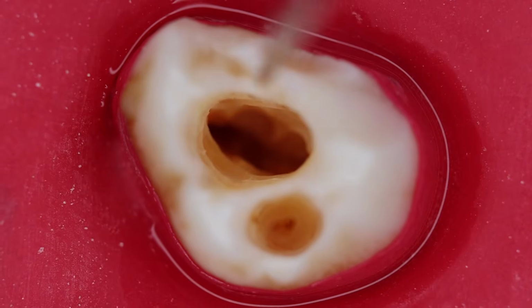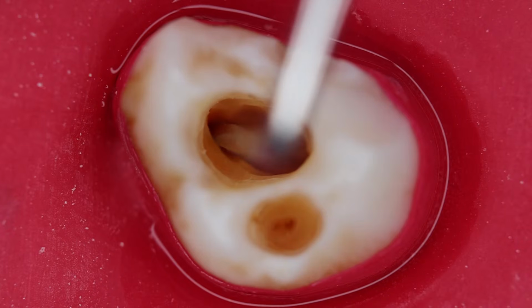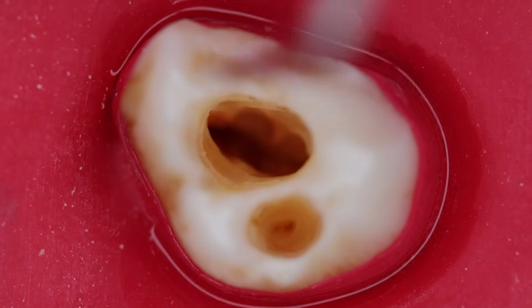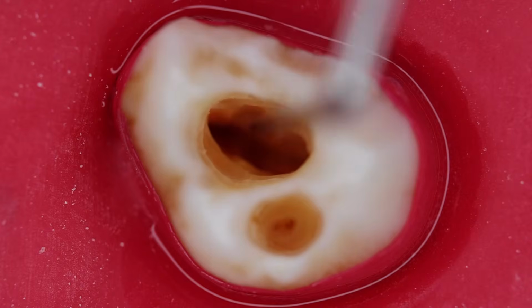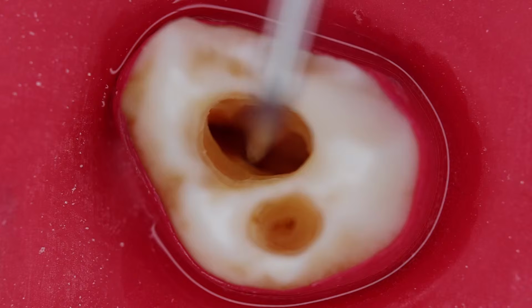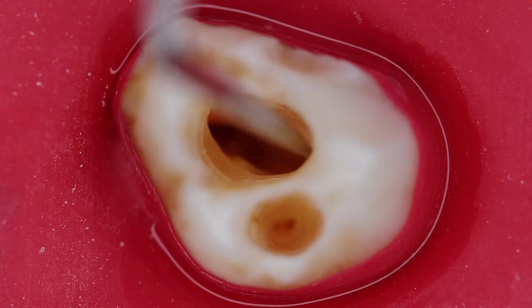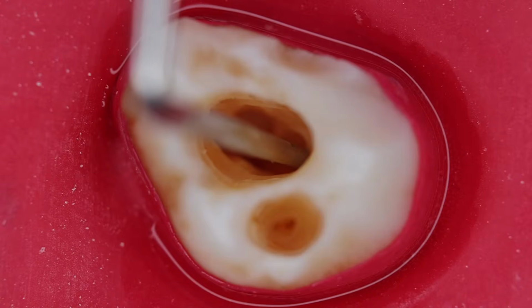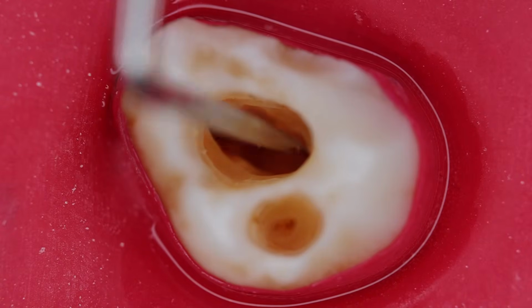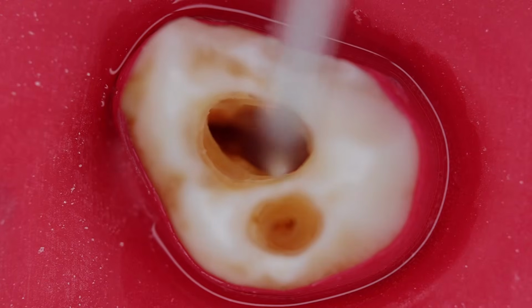So let us just quickly have a look. Over here, this is a mesobuccal canal just underneath the mesobuccal cusp. Then comes the distobuccal canal over here. Your probe should get engaged. This is the distobuccal cusp, and then this is the palatal canal, the large single canal over here. These are the minimum canals that you should be able to find.